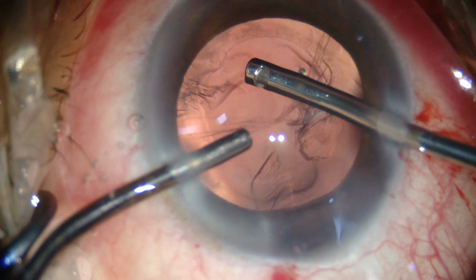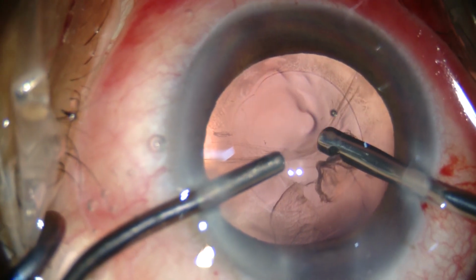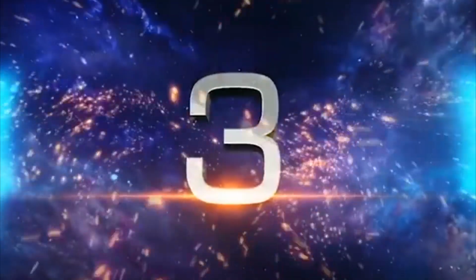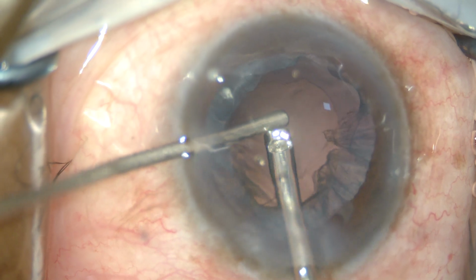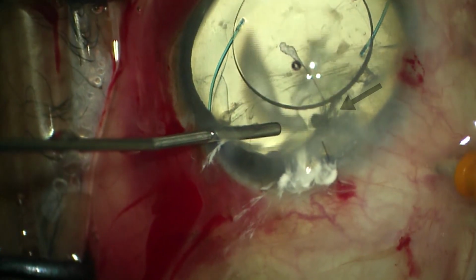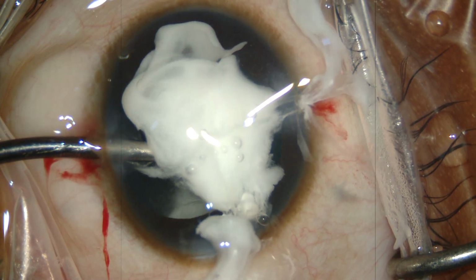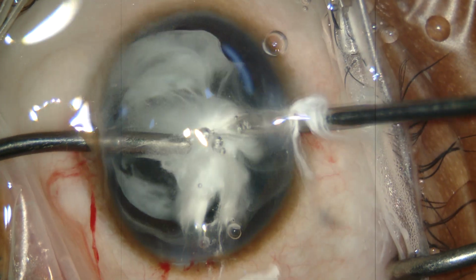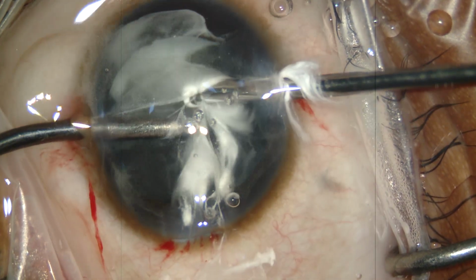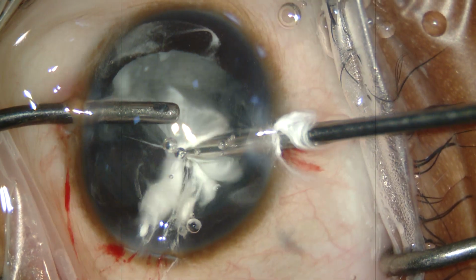By bimanual I mean there is a separate anterior chamber maintainer and a separate port for the cutter. Number 3, limbal anterior vitrectomy or pars plana anterior vitrectomy. Number 4, use of preservative-free triamcinolone in the anterior chamber to delineate the anterior vitreous for the anterior vitrectomy, either through the limbal or the pars plana route.